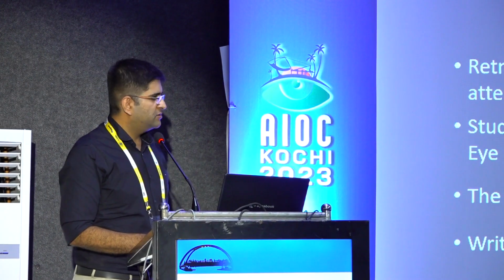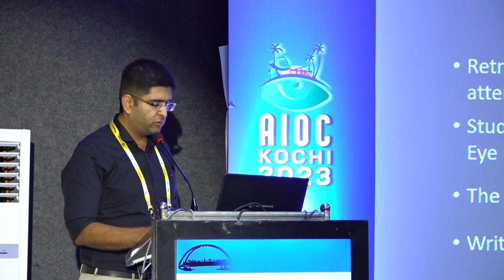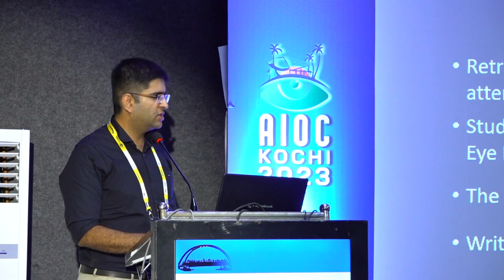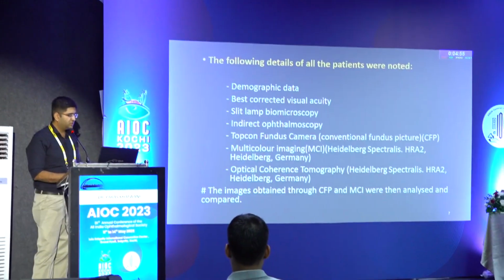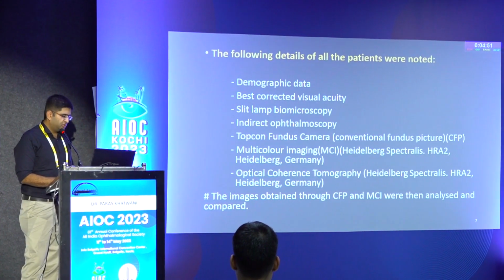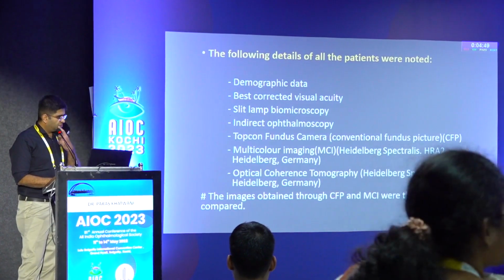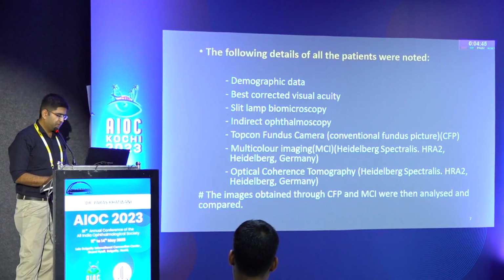So it's a retrospective study regarding the ocular imaging in optic disc melanocytoma patients. Ethical approval was obtained and written consent was taken from all the patients. The following details were noted in all the patients: the demographic data, the best corrected visual acuity, complete ophthalmic examination, and ocular imaging was done using Topcon fundus photograph, which recorded the conventional fundus photo, and multicolor imaging and OCT scans were recorded using Heidelberg Spectralis machine. The images obtained through conventional fundus photograph and MCI were then analyzed and compared.